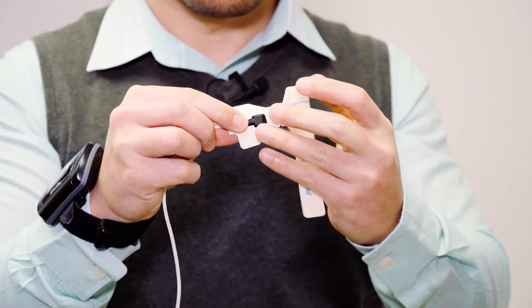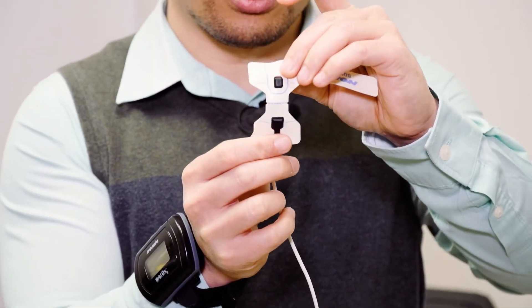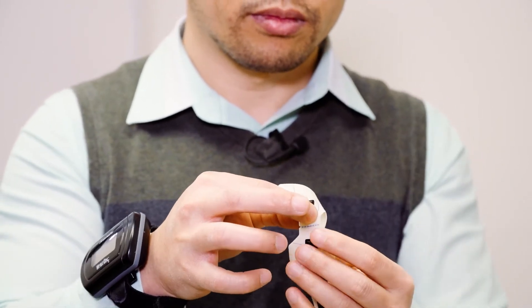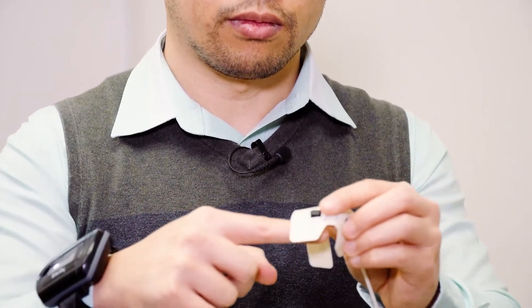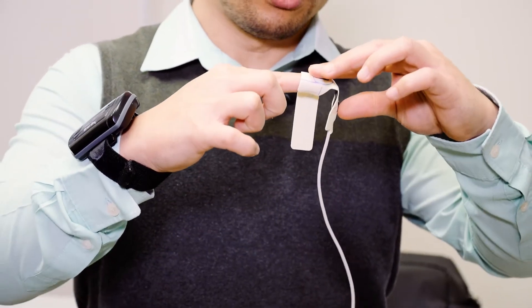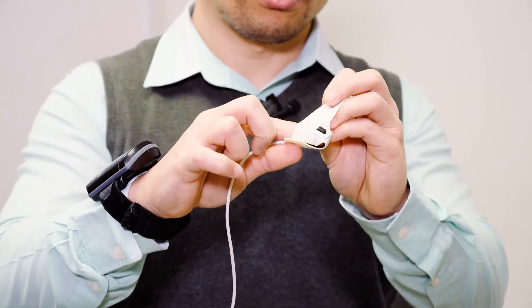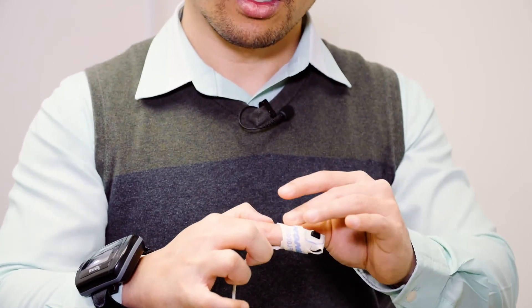The square prominence goes into the square hole, and the other one goes into the other opening. There's a drawing for the finger on the adhesive, so your finger goes like this, and you can just stick it in place. This one curves around your finger like so, and you can just wrap it around. It doesn't need to be too tight — as long as it's stable and staying in place, that should be good.